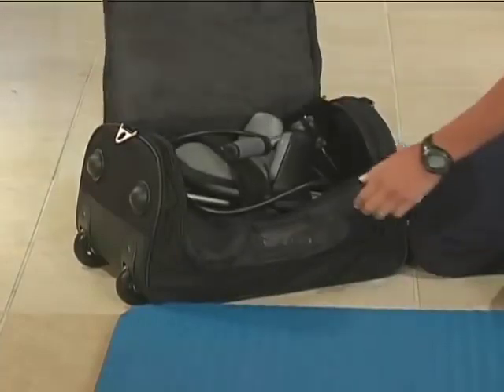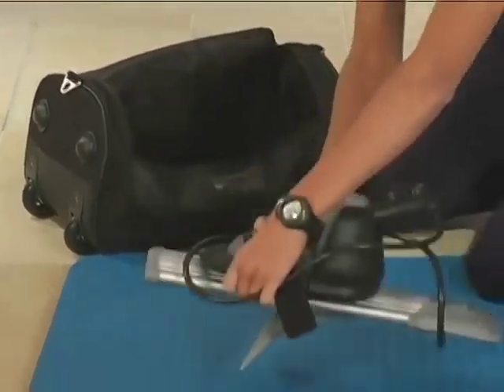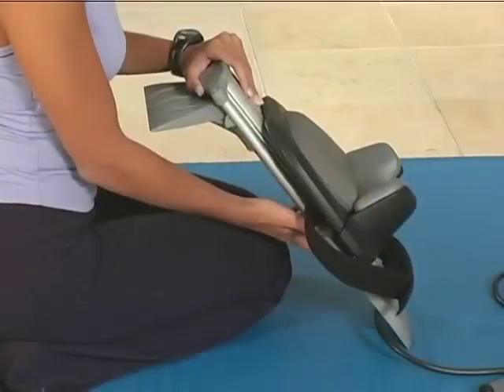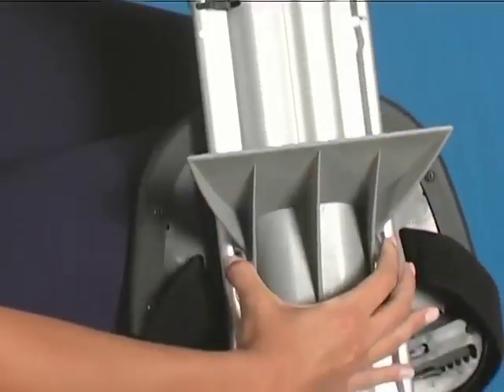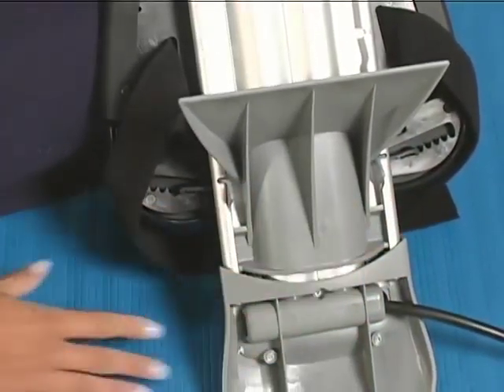To begin, place the ComforTrac cervical traction device on a flat surface such as a carpet or mat. Set the angle of traction as instructed by your healthcare provider. To change the angle of traction, turn the unit over, then lift and slide the base to the 10, 15, or 20-degree position.